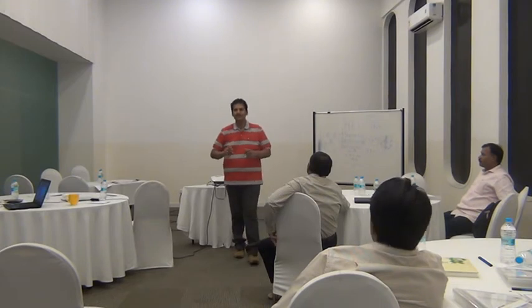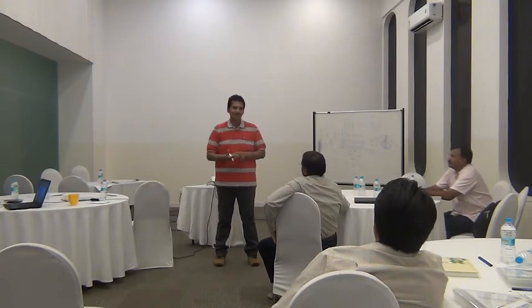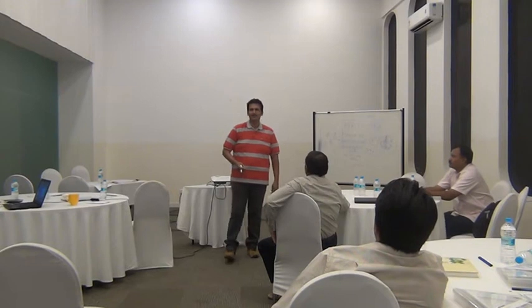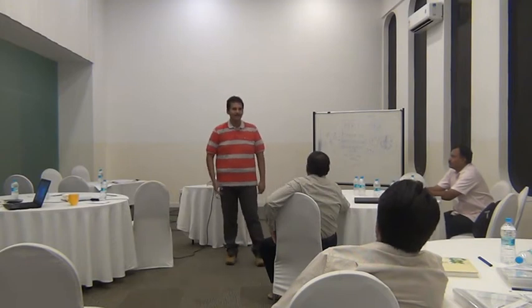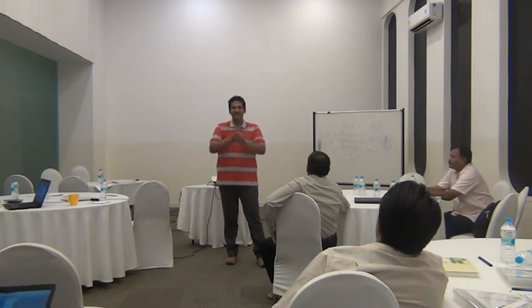It's like this. The magnet is the faculty who is coming inside. Students are the protons. Suppose a very new recruited faculty comes inside the class. Not all will orient immediately. We know that guy is an M.Tech, he studied here. Why should you immediately respond to him? So he will be quiet. Suppose a very well-trained faculty comes. The orientation increases. HOD comes. Still further the orientation. Suppose the principal comes. The orientation further increases. So the orientation depends upon the strength of the magnetic field.